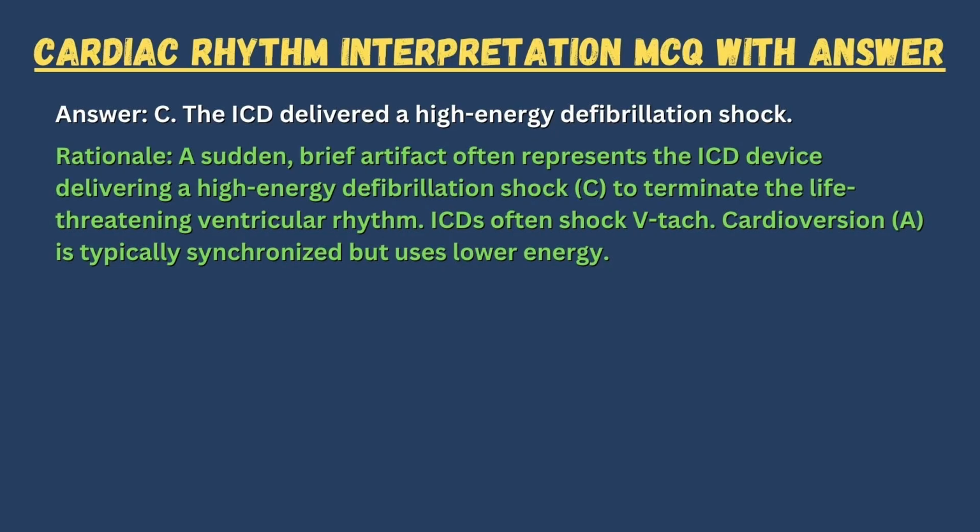Rationale. A sudden brief artifact often represents the ICD device delivering a high-energy defibrillation shock, C, to terminate the life-threatening ventricular rhythm. ICDs often shock V-Tach. Cardioversion, A, is typically synchronized but uses lower energy.